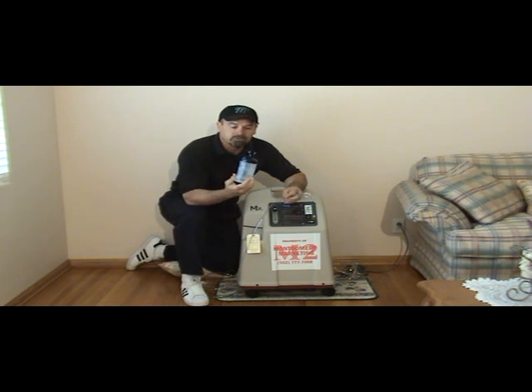This is a humidifier bottle that we provide in the home setting. This is a reusable humidifier bottle. This humidifier bottle should be used only with distilled water. Now, if you're first setting up and you want to use tap water the first time, then we do allow people to do that. But for extended use, you should use distilled water only.